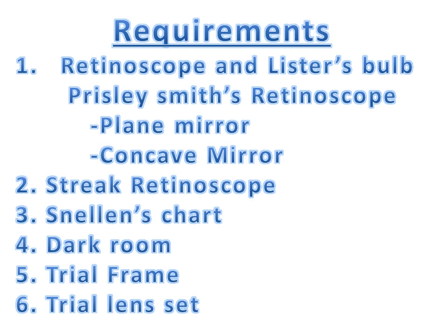This procedure is normally done in a dark room so as to accentuate the fundal glow which we see in this particular procedure. You have to have a set of trial frames. You have to have a trial frame, and you have to have a set of trial lenses. Trial lenses will be in the form of plus and minus spherical and cylindrical lenses.